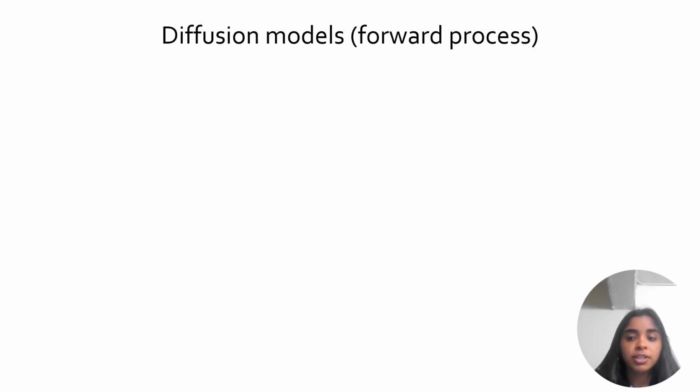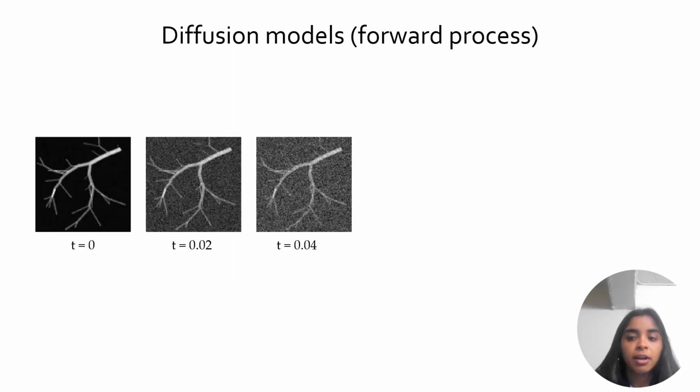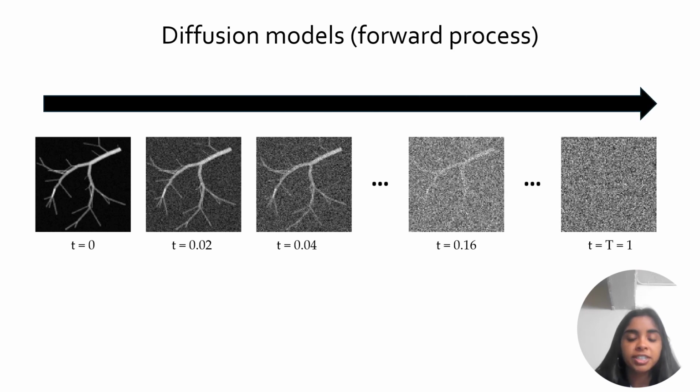A diffusion model is trained by considering a noising process, whereby each clean image from the training dataset is progressively noised until it approaches a sample from a simple Gaussian distribution. The diffusion model learns to denoise each of these noisy versions of the image.